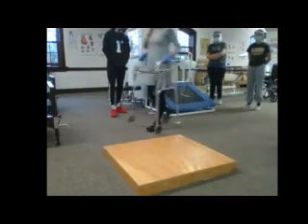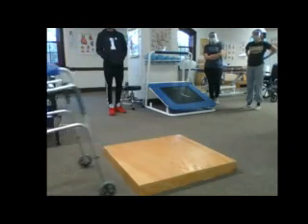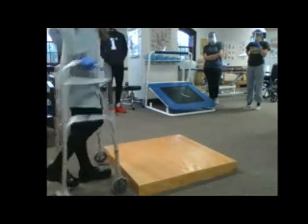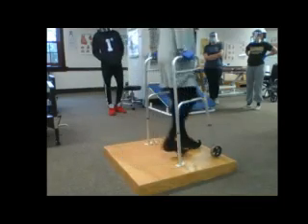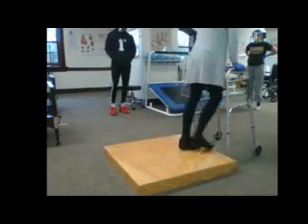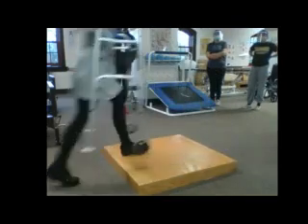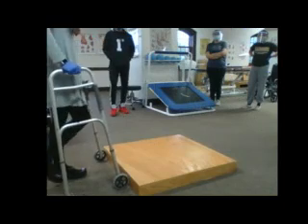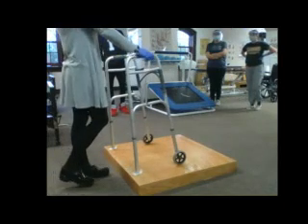There are times when somebody might be non-weight bearing, and they can do it the same way, just maintaining their non-weight bearing. However, for some people, the getting up part when they're non-weight bearing can be a little bit tricky because the walker's higher depending on how high the step is.